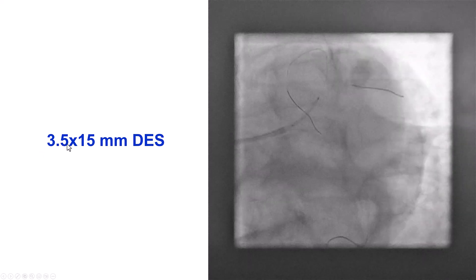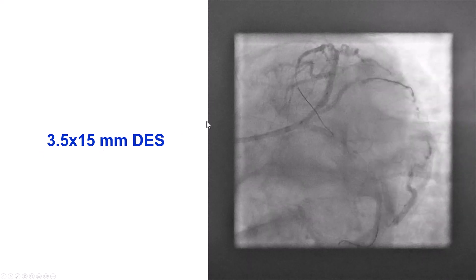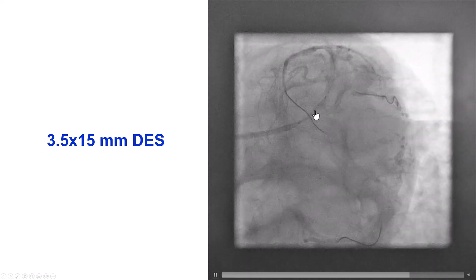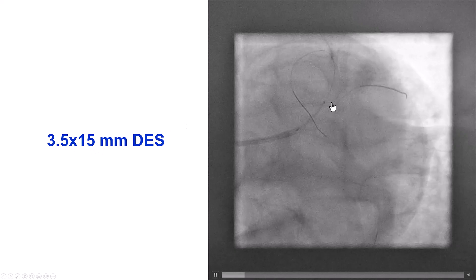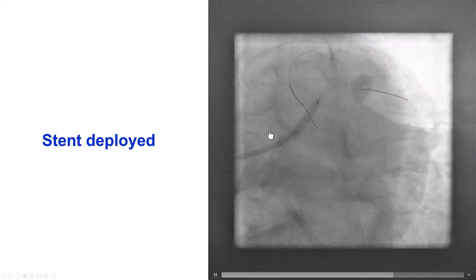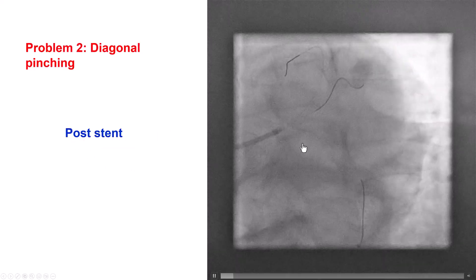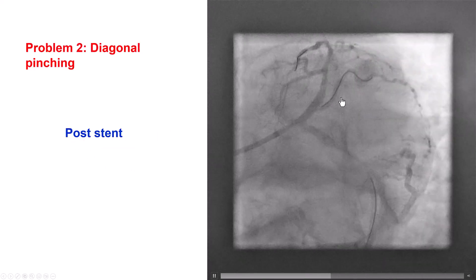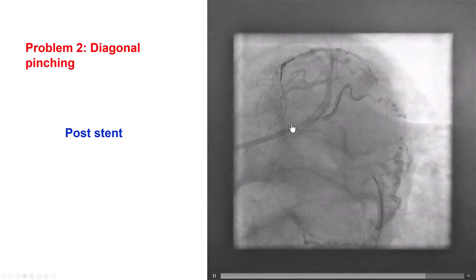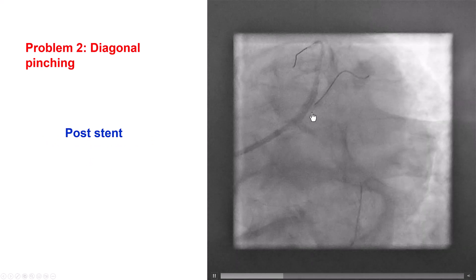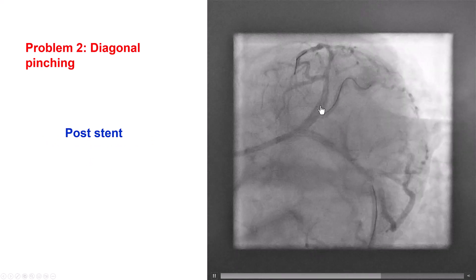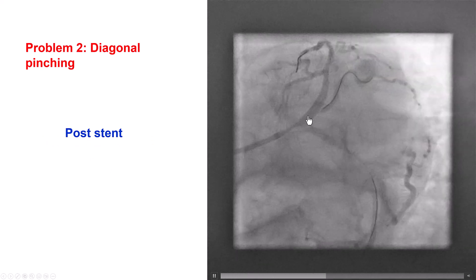This is the stent — a 3.5 by 15 mm drug-eluting stent. We are jailing the wire into the diagonal. We placed the stent and did have a good result into the LAD. The dissection has been covered.